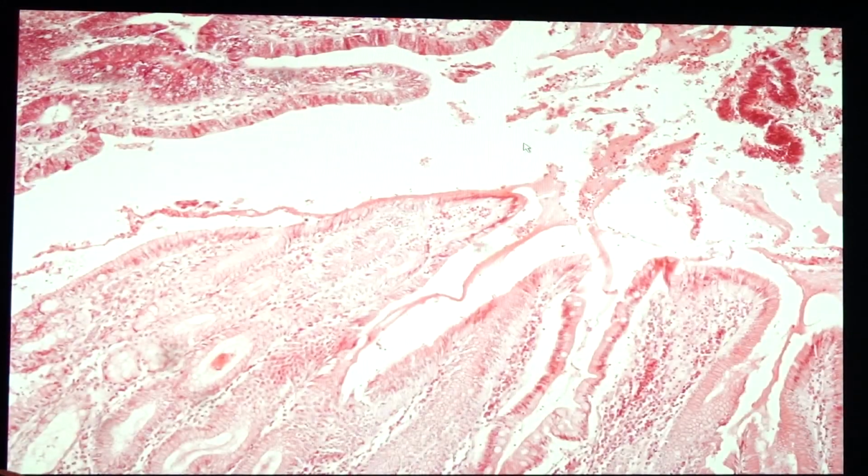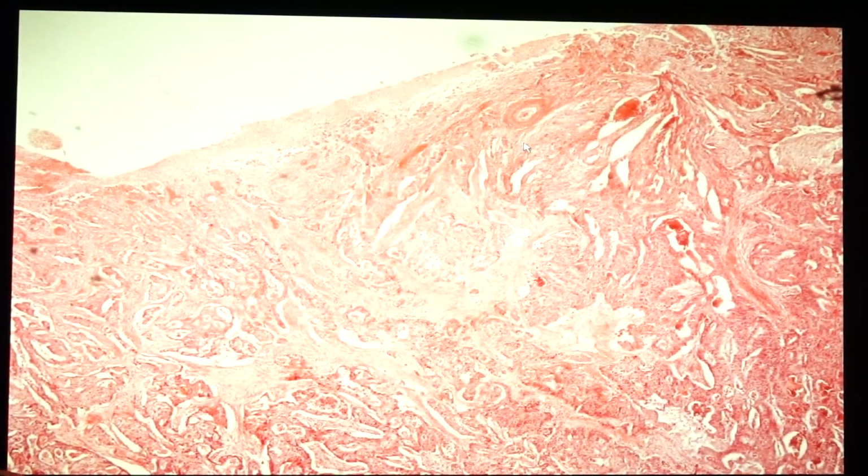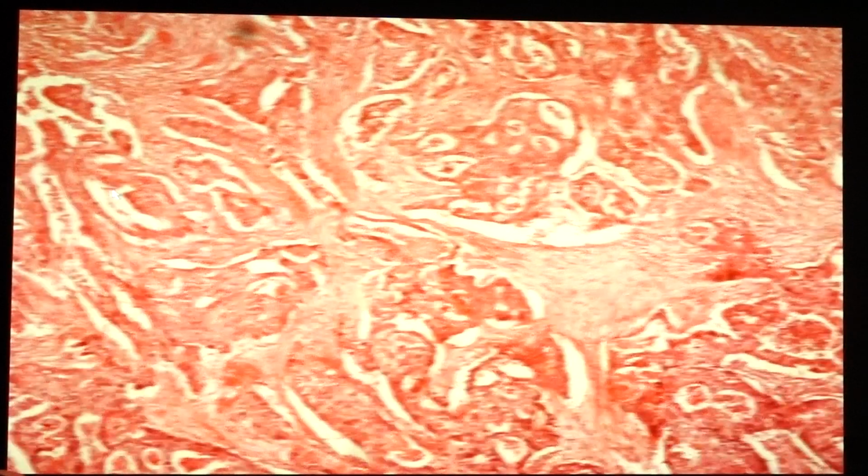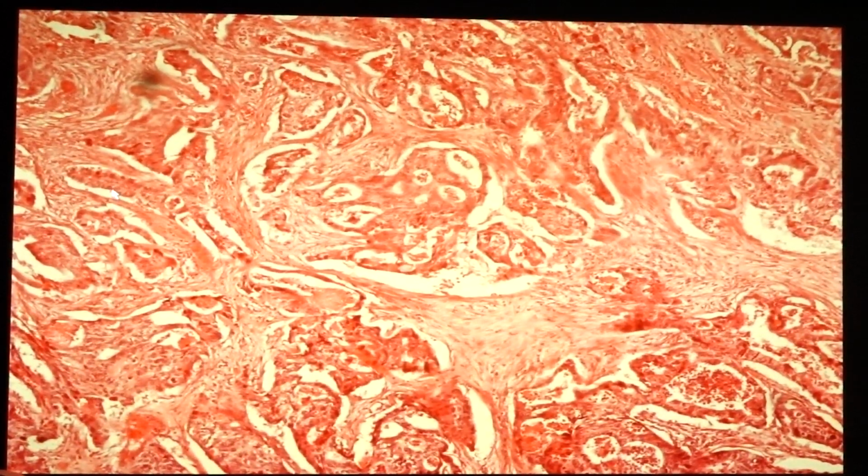So this is labeled as ulcerating gastric adenocarcinoma. What we have to look for is the presence of the ulceration, which is located at the surface. This would contain the presence of necrotic debris. Gastric adenocarcinoma accounts for 90% of all gastric cancers.